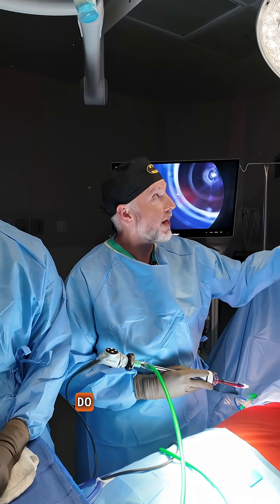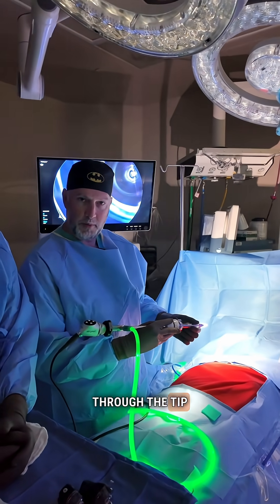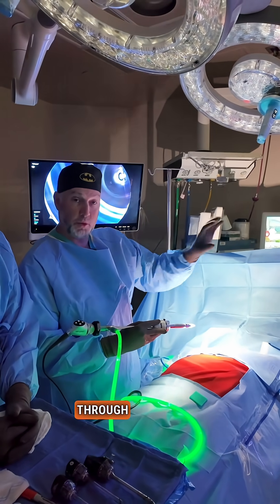In laparoscopy, we do have the surgical lights on until we get into the abdomen. What you can see is that we have LED lights that come out through the tip of our scope, so this way we can see what's going on in the abdomen. We have screens that are all lit up, and we're operating through the screens themselves.